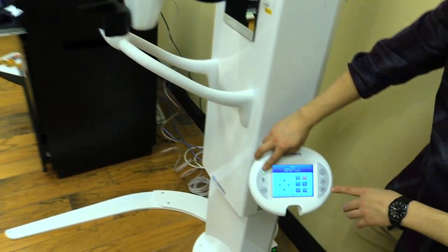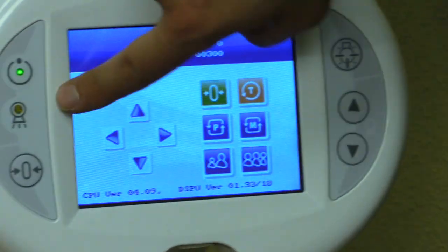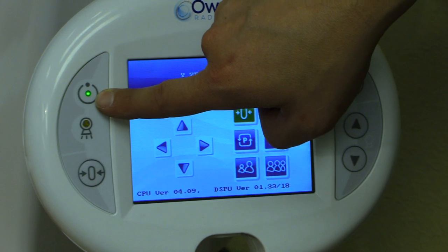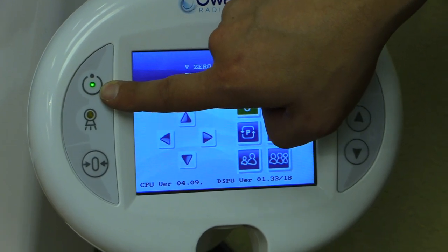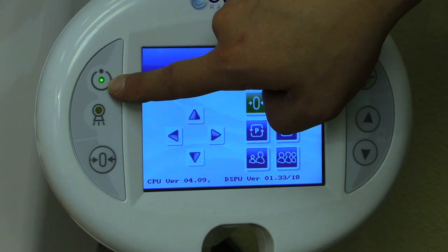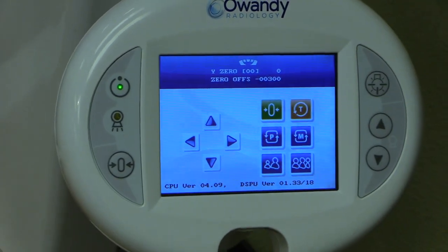Looking at the control panel, the green light has been turned on — that means we are ready to fire or acquire an image. At this point we need to set up the software so we have an image to examine and determine whether we need to move the sensor or the x-ray beam.